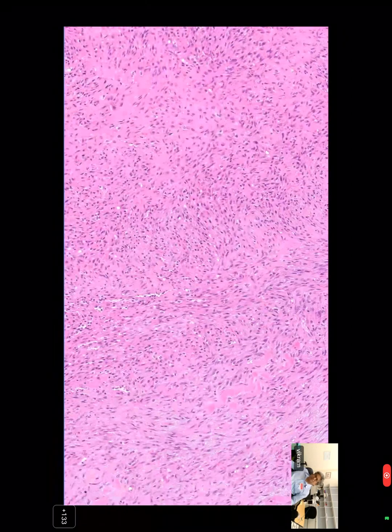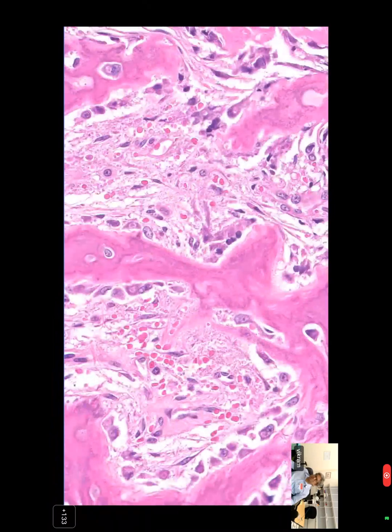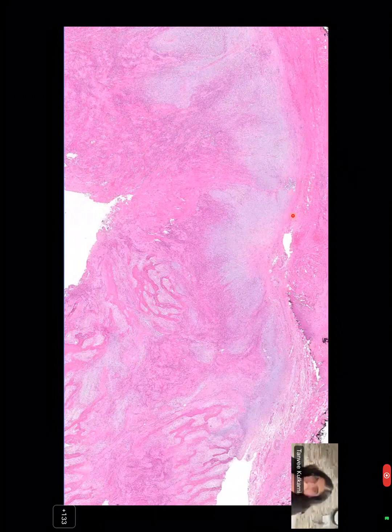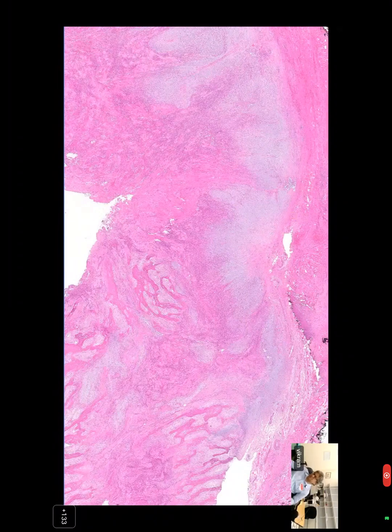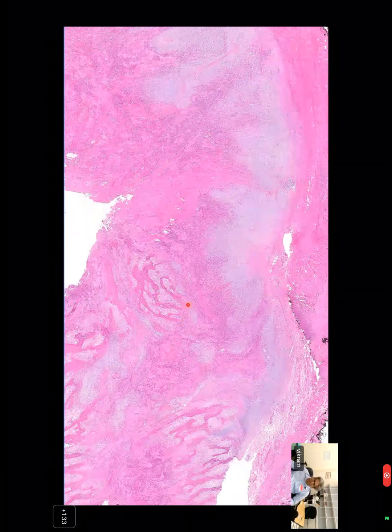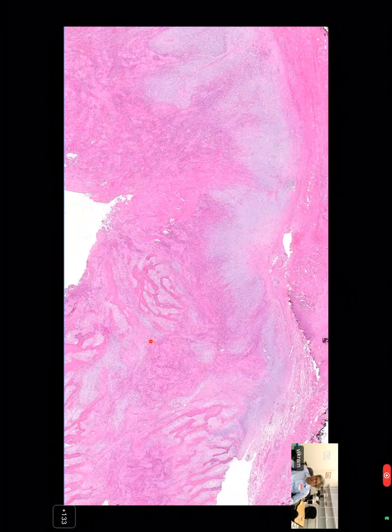And I think the clue that this is myositis ossificans, there are many, many clues. One is that extraskeletal osteosarcomas are extremely uncommon. Before you think of an extraskeletal osteosarcoma, always think of myositis ossificans or even heterotopic bone formation.